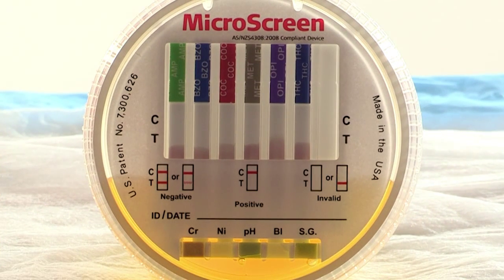Now this is another sample from another person which we are also running, and you can see the urine starting to migrate up the strips, visualised by the pink colour. Once again, we will be looking for whether lines are going to appear in the C zone, the control zone, and whether lines are going to appear in all of the T zones or the test zones.